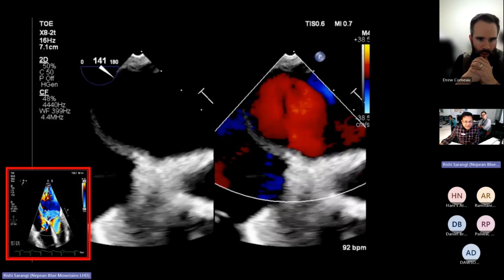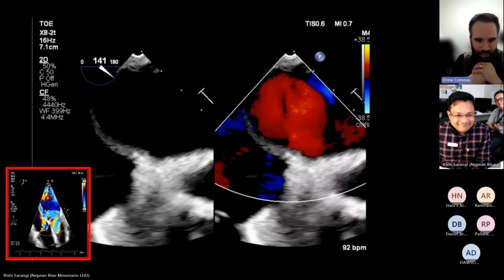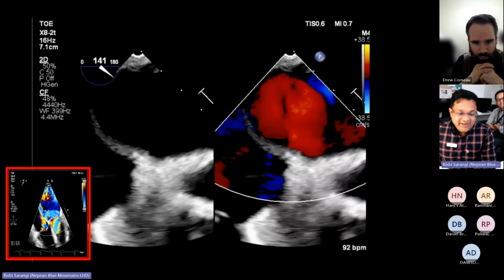Okay. And also one interesting thing which was happening here. We're looking at the interatrial septum. What do you think is happening? You have fixed bowing of the interatrial septum, and I can't see in this particular view, but if there was a PFO, it appears aneurysmal, which means it could have an ASD or a PFO underneath. So you could have shunting, although I'd probably go bicaval, but yeah. It was a bit tricky, but after a lot of interrogation, that was exactly our initial thoughts, what you said.